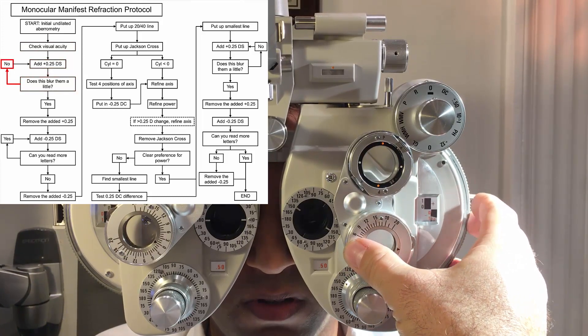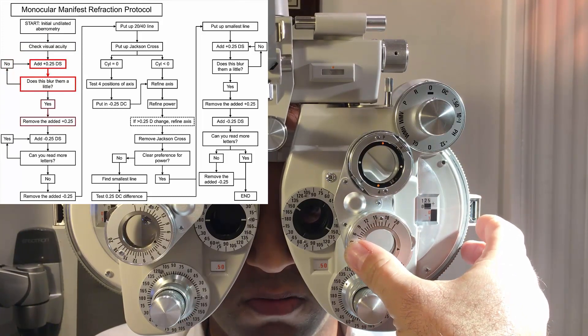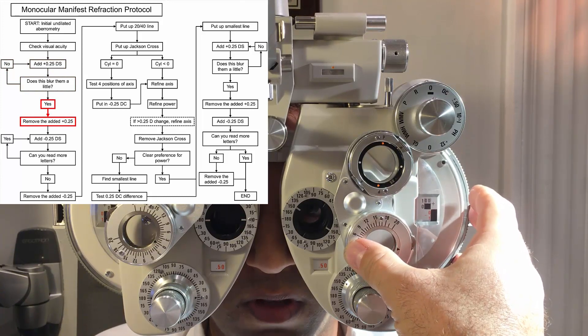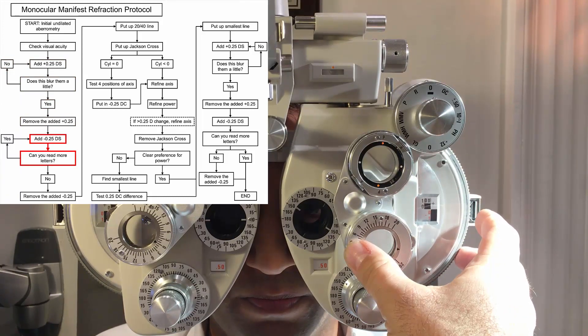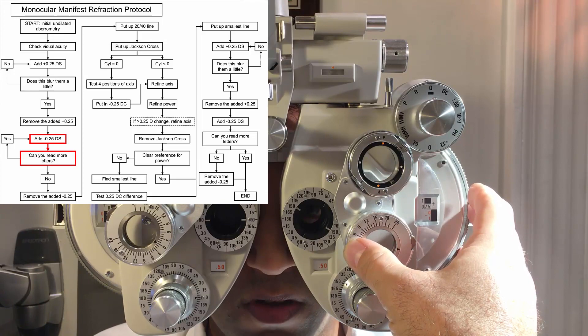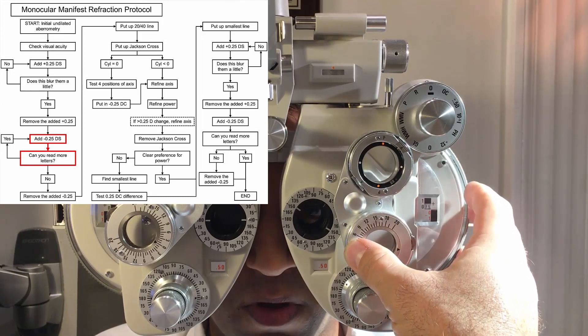Can you still see the H if I go to there? Yeah, but it's... Still see it if I go to there? No. So it's better here? Yeah. And between one and two, the same? No. Two is... Slightly better on two?